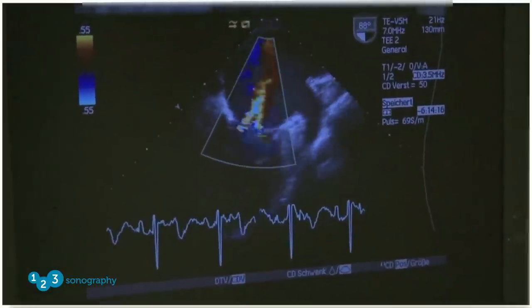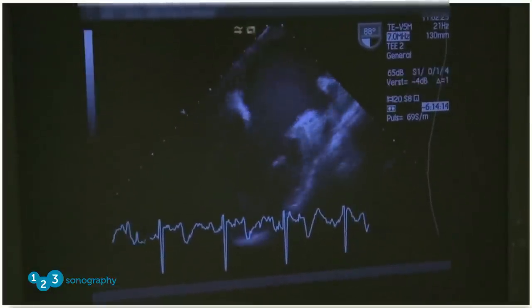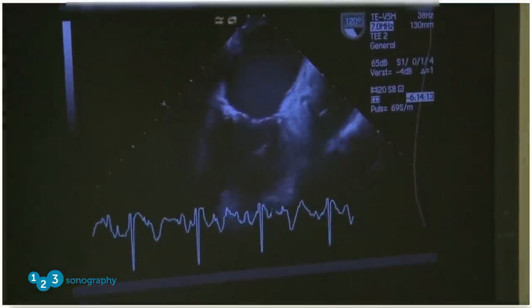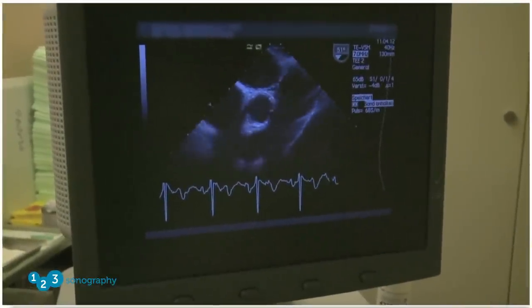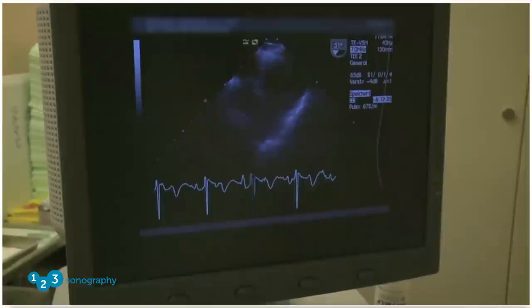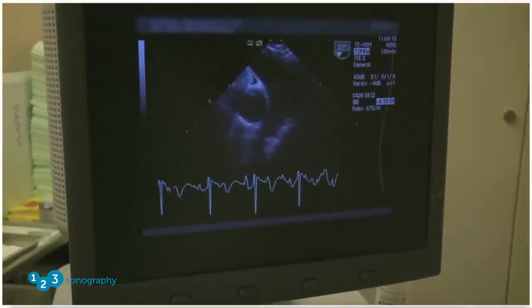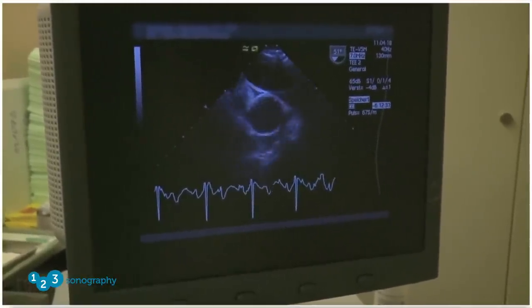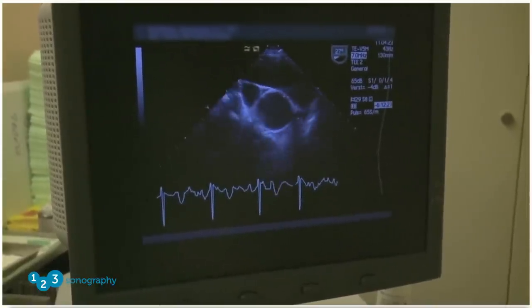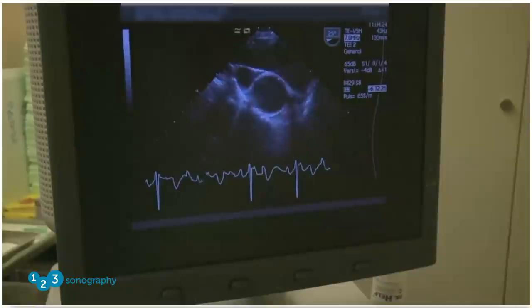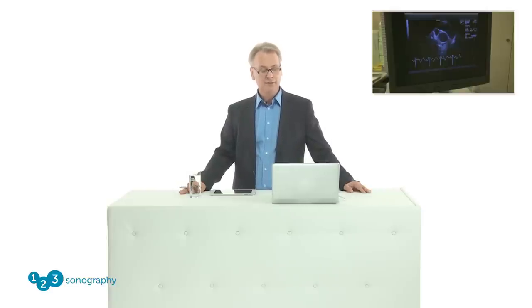We use all the different modalities necessary — here you see color Doppler being applied. We rotate the probe and acquire all the necessary views. We usually don't perform all possible views but focus on what is necessary; an exam takes no more than five to seven minutes unless there's unclear pathology. We're always trying to reduce the discomfort of the patient as much as possible.